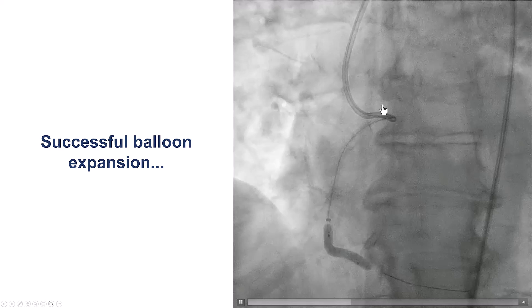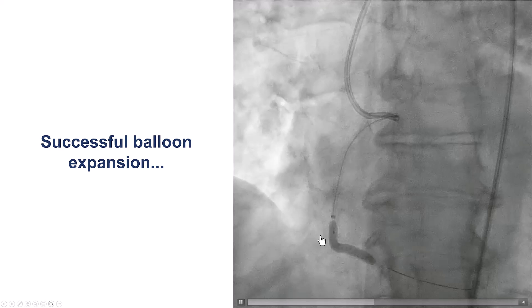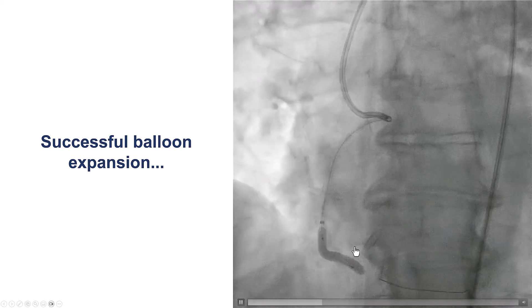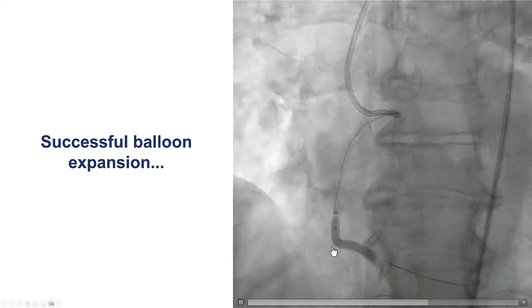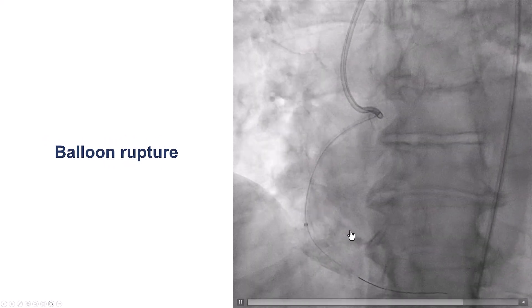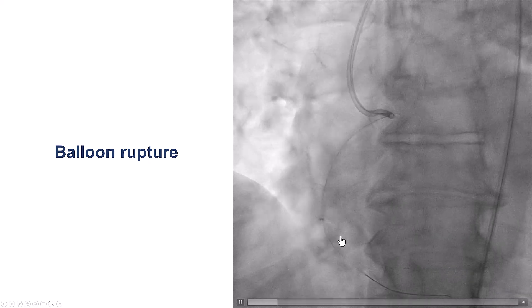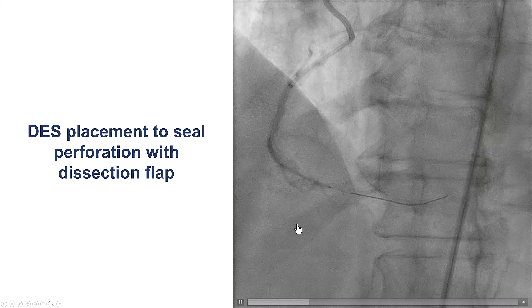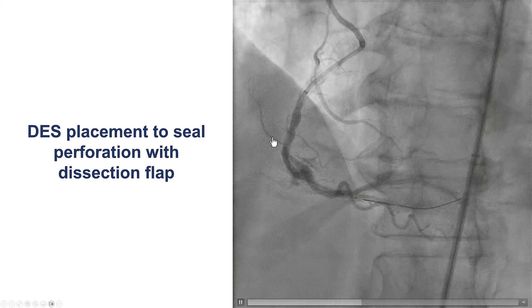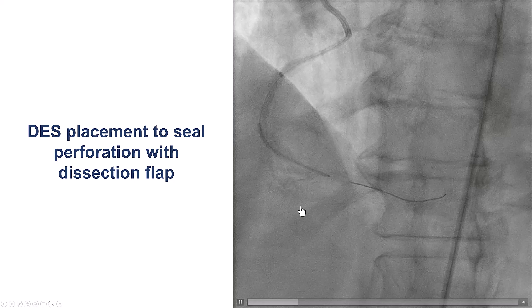So how to deal with this? The simplest step is to try with high-pressure balloon inflations, and using an NC balloon we were able to successfully expand the lesion. Unfortunately, at this point the balloon ruptured. We then saw staining of the wall of the right coronary artery. We thought this might just be a dissection, although it seemed to go deep into the wall.